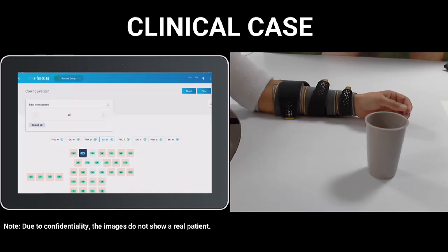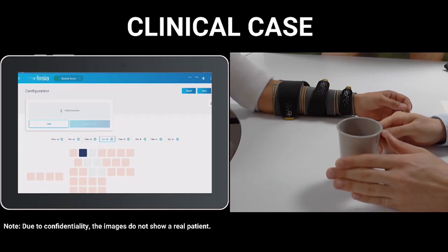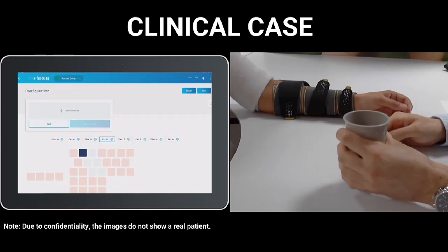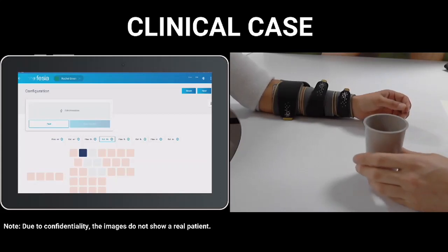which is already preset, with this cathode at 14 milliamperes. And what I'm going to do is to ask Rachel to grasp the glass, and in the moment that she is being here, I am going to help her by extending her thumb to grasp it better, okay? And the same thing while releasing the glass. Let's try it now.